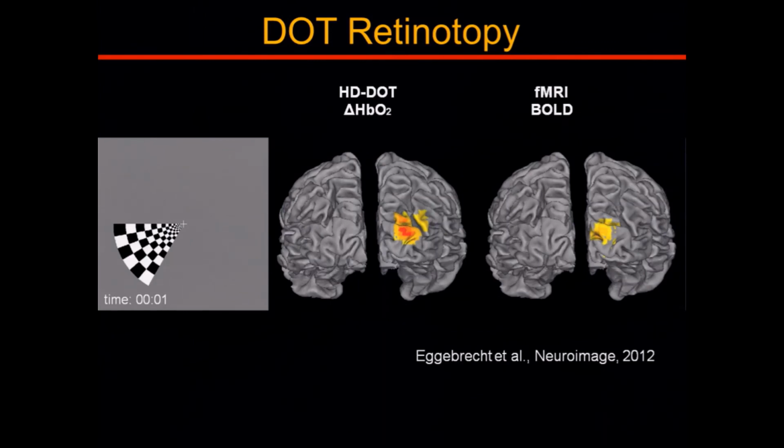So one of the nice things about doing functional responses in humans is that it gives you a way of sending test patterns into the brain and looking at if you get them back the way that you'd think you would get them. And the visual cortex is a particularly nice place to do that because you can put different patterns on your computer screens and then get different patterns in the brain to test things like resolution, accuracy, and that type of thing.